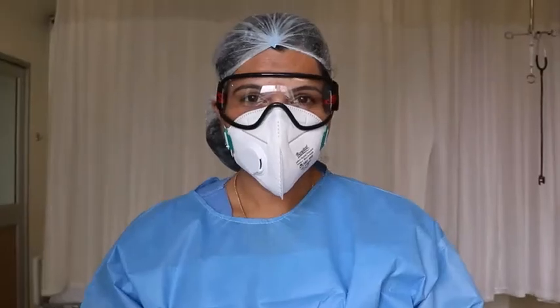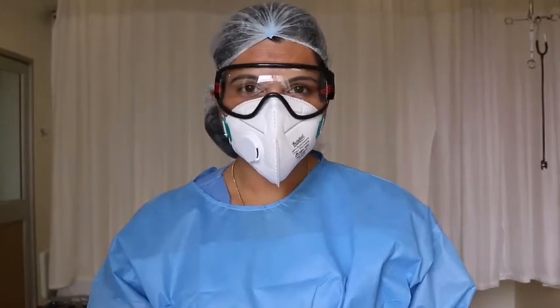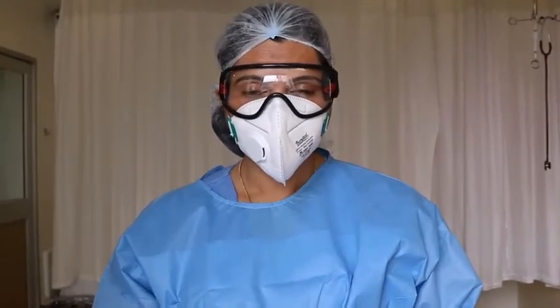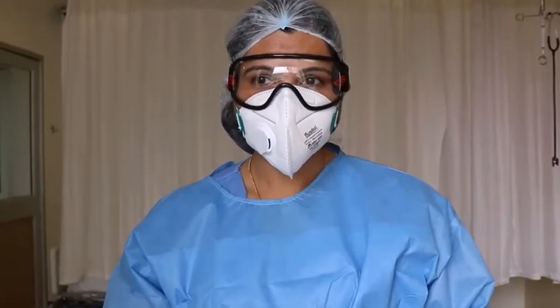I will now demonstrate the sequence of taking off PPE. The sequence is as follows: first remove gloves, then goggles, then gown, and last remove the mask. Except for the N95 mask, all other PPE should be removed inside the patient room. The N95 mask should be removed outside the patient room.